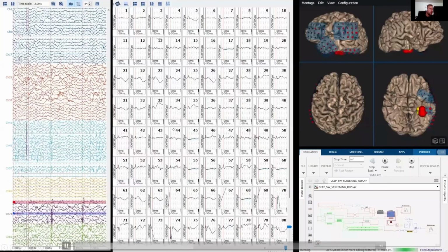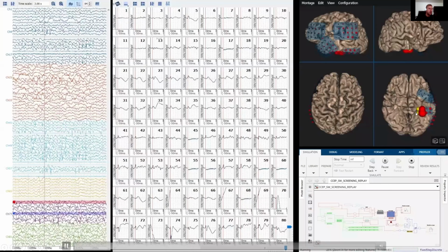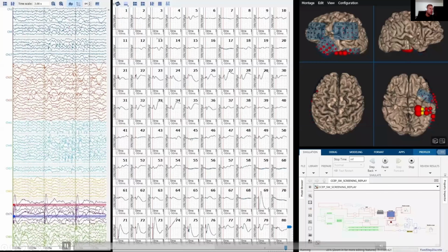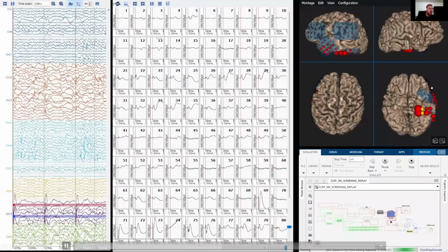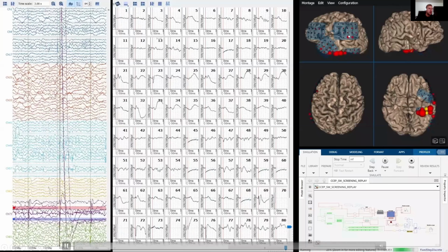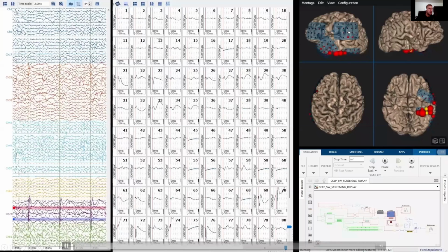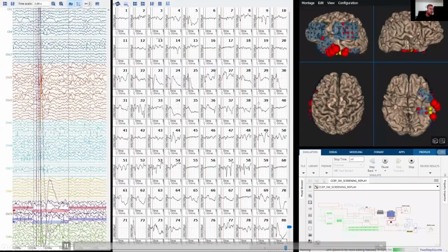So here, for example, that was a silent area. Now we are switching here on the ventral temporal cortex, and we can see there are very strong connected areas, and we can see also these distant patterns that are interconnecting different cortical regions.